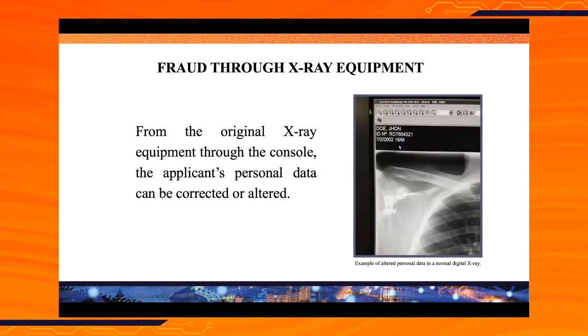From the original X-ray equipment through the console, the applicant's personal data can be corrected if it is an error, or altered in a fraudulent way. This is an example of altered personal data incorporated in a normal digital X-ray to commit fraud.